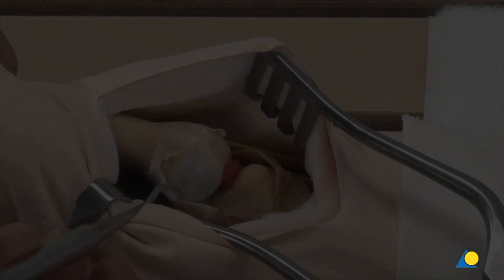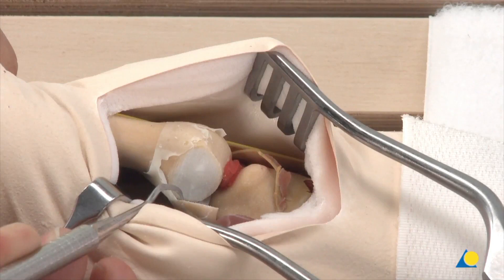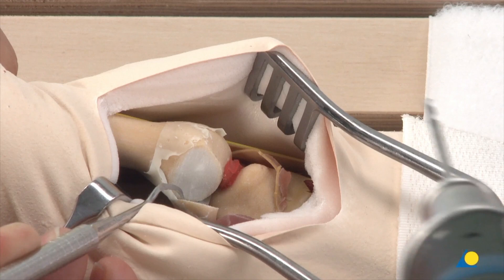In this exercise, the Bennett fracture is stabilized with two lag screws inserted using the so-called inside-out drilling technique. This means that the gliding holes are drilled from the fracture surface of the shaft fragment to the dorsal side of the first metacarpal base. Following anatomic reduction of the shaft fragment onto the Bennett fragment, the thread hole in the Bennett fragment is drilled using a standard technique. Care is taken to ensure that the direction and distance between the two gliding holes are such that the screw tips will have enough separation in the Bennett fragment. The first gliding hole is drilled with a 2 mm drill bit beginning at the fracture surface and aiming in the dorsal radial direction at a 90 degree angle to the fracture surface.